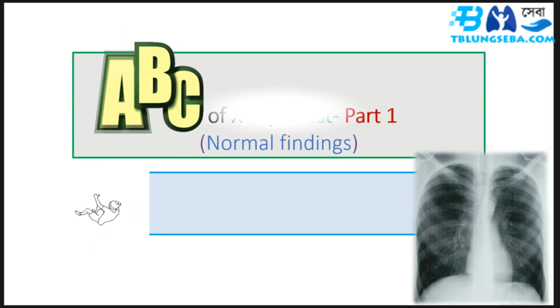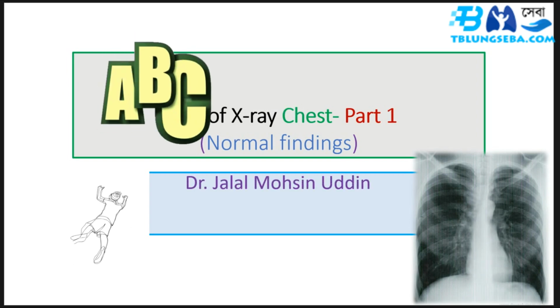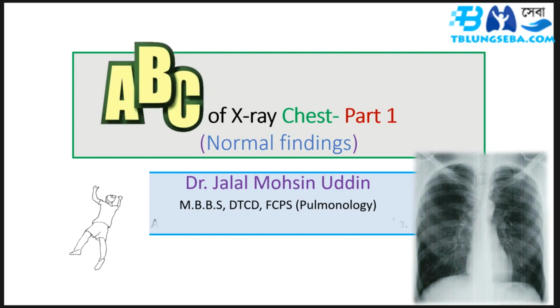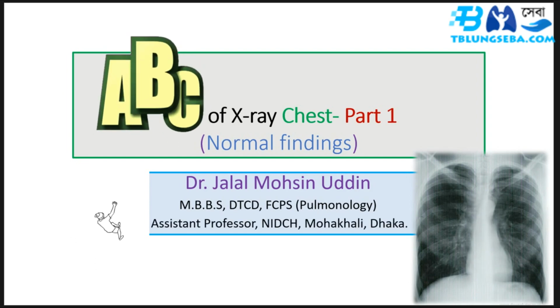ABC of X-ray chest Part 1, Normal Findings. Dr. Jalal Mohsin Uddin, M.B.B.S, DTCD, FCPS, Pulmonology. Assistant Professor, NIDCH, Mohakhali, Dhaka.